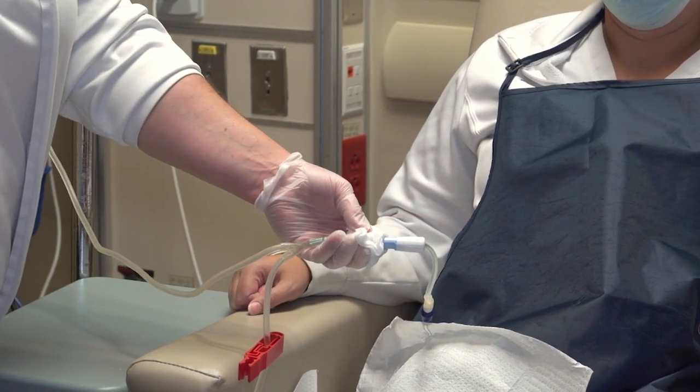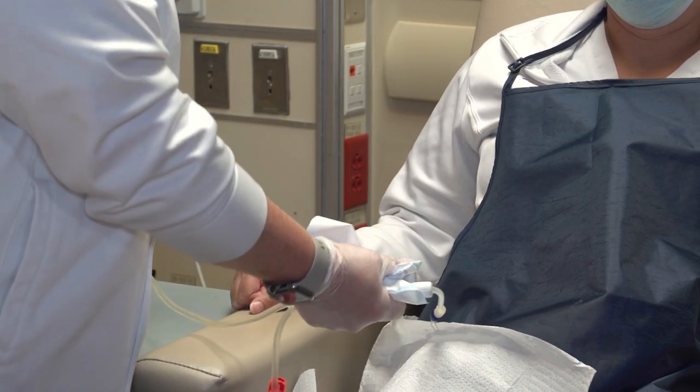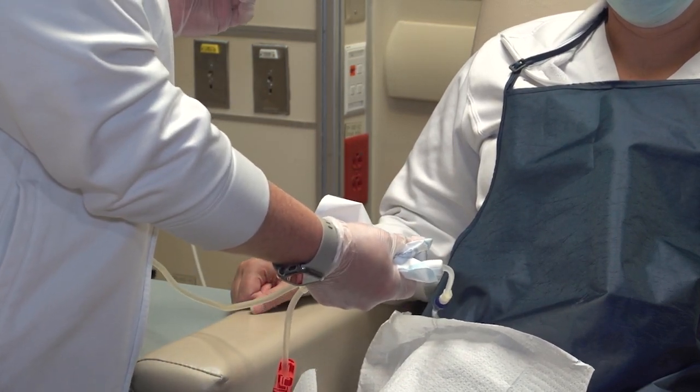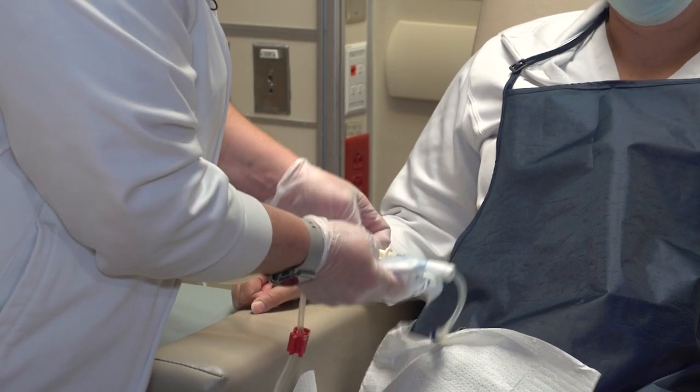Once it's been scrubbed for 1 minute, you'll wrap it and let it soak for 1 minute.